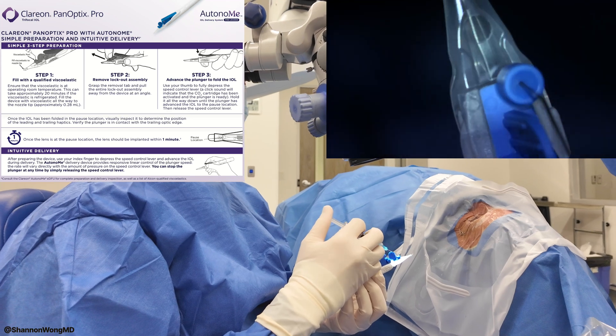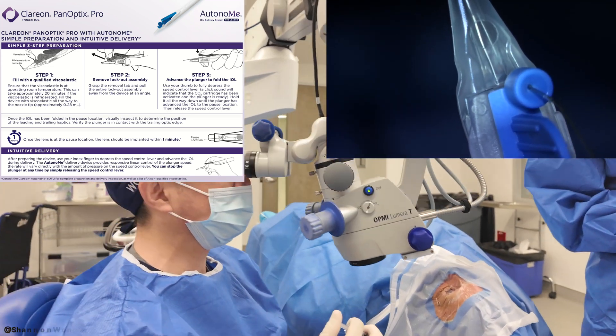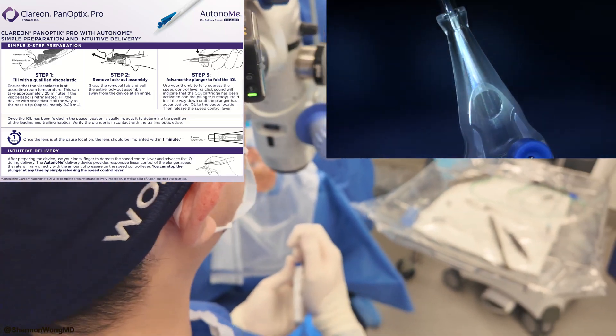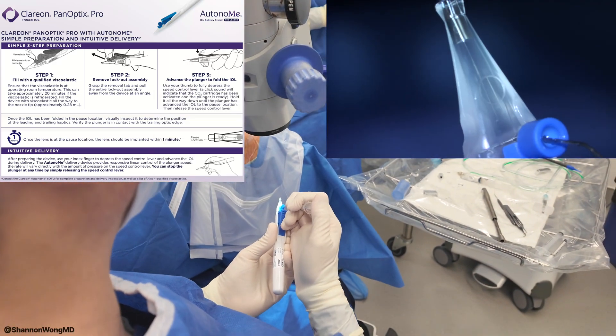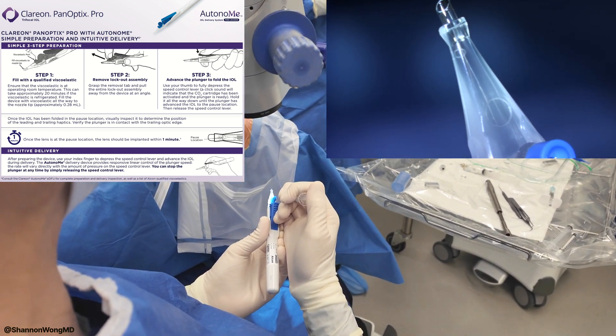We're going to place this viscoelastic into the hole and we'll see it move into the plastic in front. I'll go to about right there.